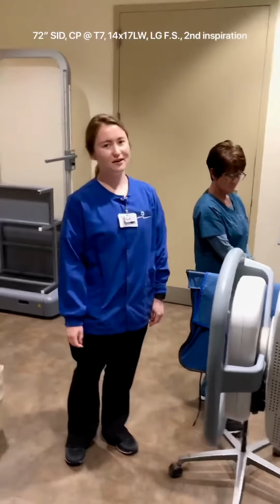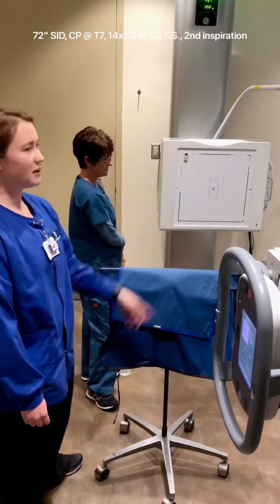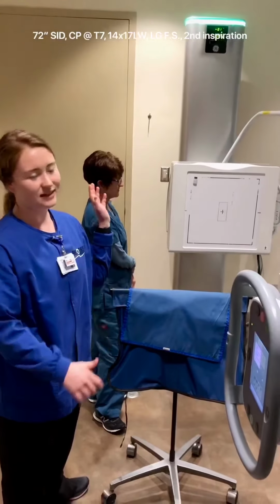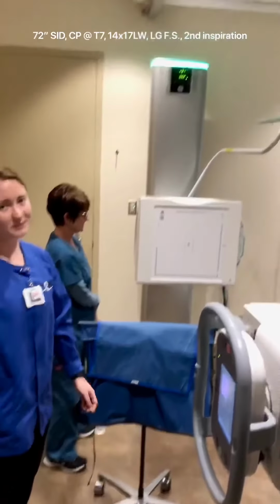First, you're going to start off and make sure that you have a 72-inch SID. Make sure that your tube and bucky are lined up. This room automatically lines up and it's detented, and if it's not detented, you won't be able to take your exposure. The way you know it is detented is the green light will be on.